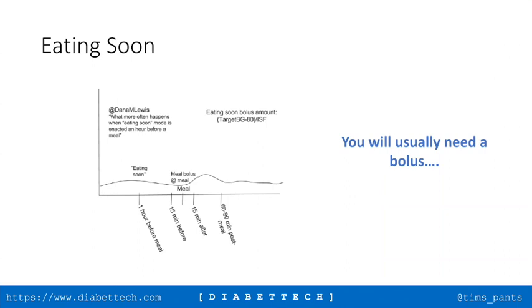You mentioned giving less insulin at the meal based on the Eating Soon having provided insulin. You mean that the calculator would do that, or do you need to calculate something? The bolus calculator will look at IOB. So if you've already got IOB, then it's going to remove that from the meal bolus, as long as in AAPS you've got the IOB consideration ticked.